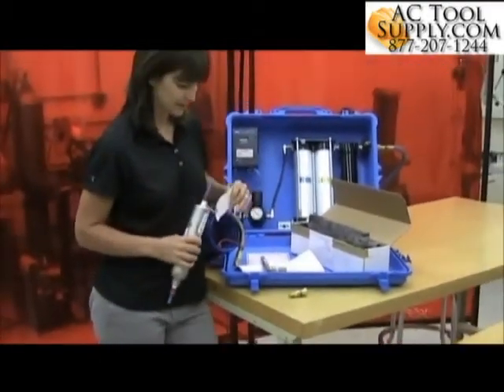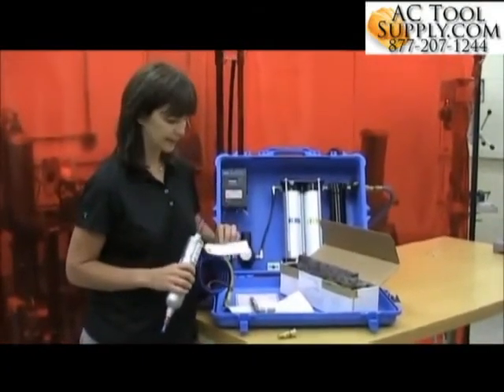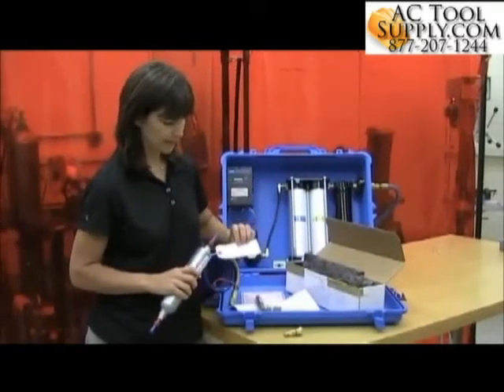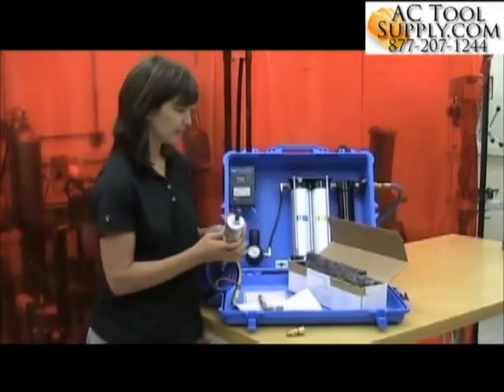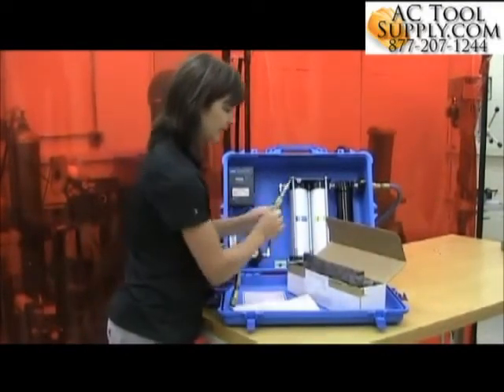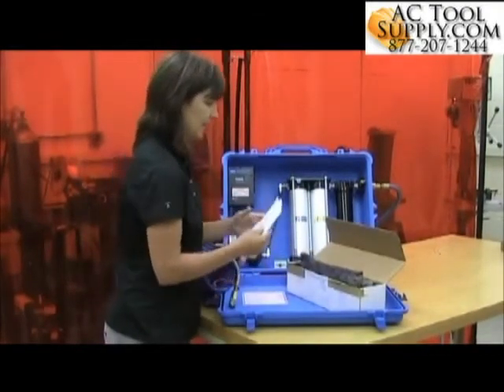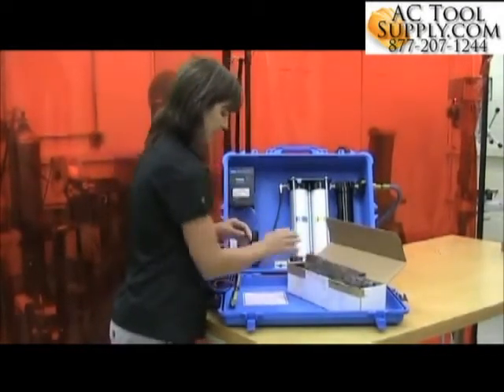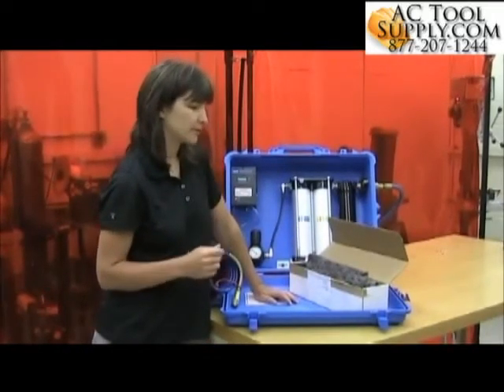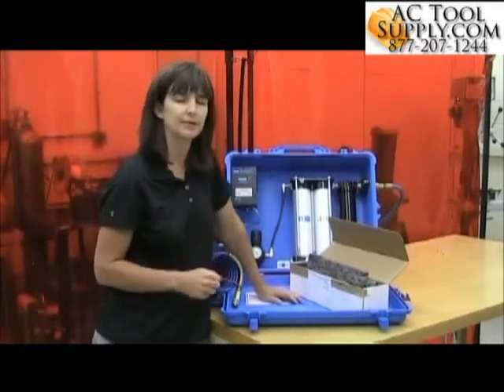The next step is to fill out any forms that come along with the kit. In this case, I've got a form attached right to the canister, so fill out the required information there. Then replace all of the components into the test kit and mail this back to the laboratory. The laboratory can then either fax or mail back the grade D test report.